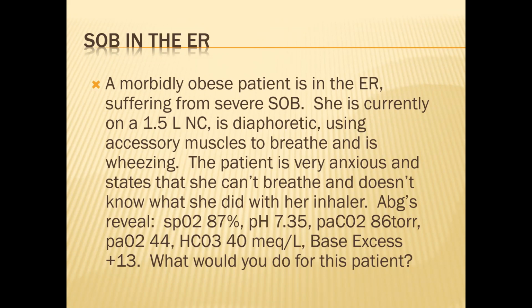What does that tell you? Yeah, CO2 retainer for sure. PaO2 is 44. Base excess plus 13. What would you do for this patient? So you would do a Venturi mask instead of a nasal cannula? Well, you could do it when you do it, but you could go to 28. Do you know why that's the better answer?